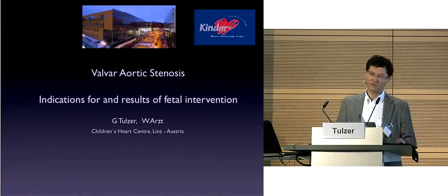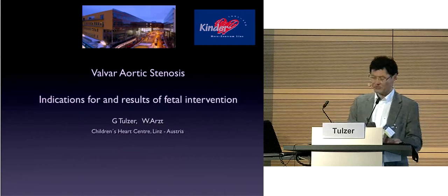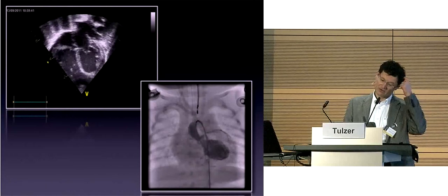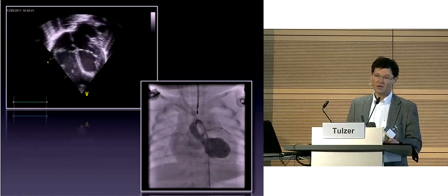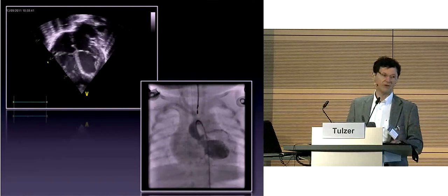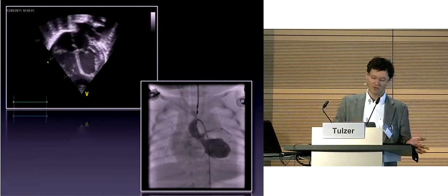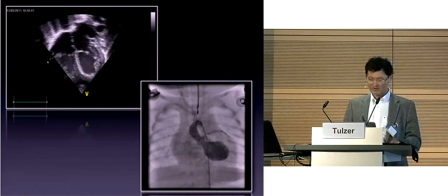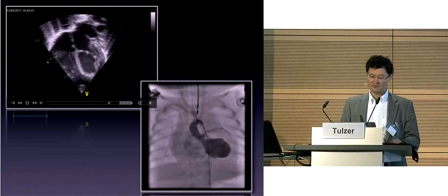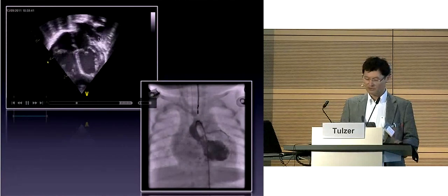But nevertheless, there were 9 months before this aortic stenosis was present and developing during intrauterine life, as we have demonstrated nicely. And then at the first echo in the neonate, you can see these kinds of hearts with some sort of borderline left ventricle, some degree of endocardial fibroelastosis, mitral valve abnormalities, aortic valve abnormalities. You can see this is a very high pressure left atrium, obviously with dilated pulmonary veins.